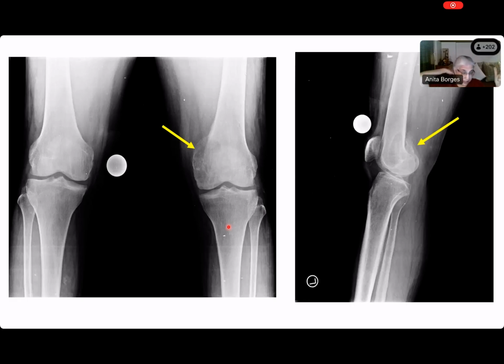We said all this, right, Sarangi? So there is a system. When we are describing histopathology, we have a system when we're describing bone. So come on now, don't do this in an unsystematic, helter-skelter kind of fashion. On this image we see a lytic lesion present on the distal end of the femur. The skeleton appears to be mature. Yes. And it is an epiphyseal to metaphyseal lesion, we can say that it is extending up to the metaphysis.